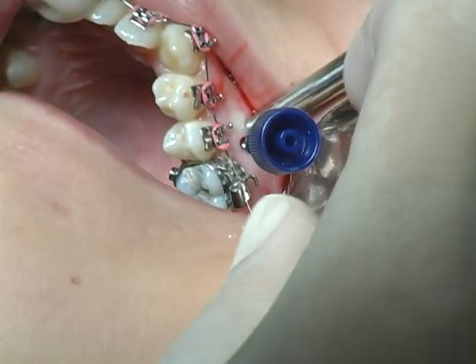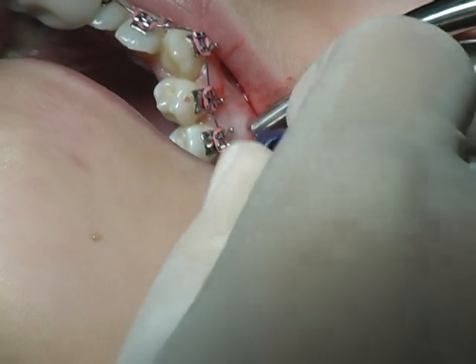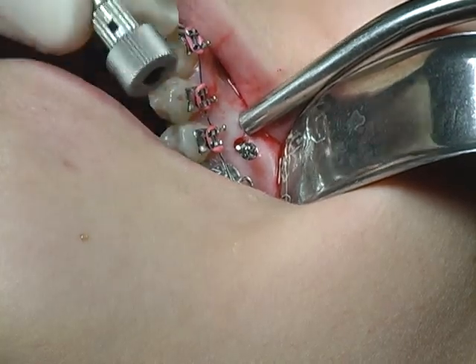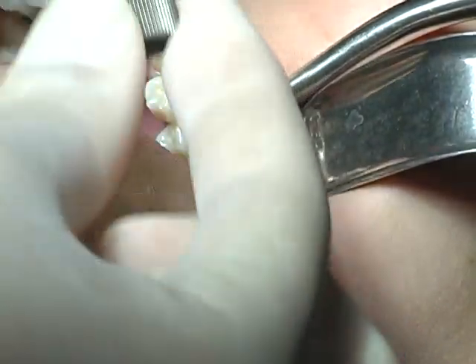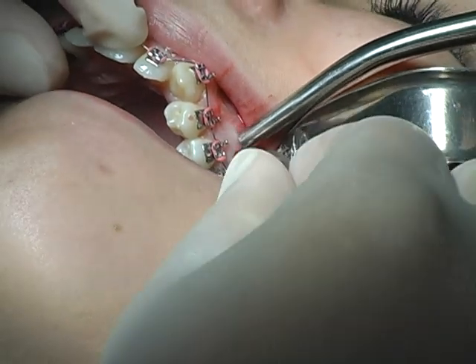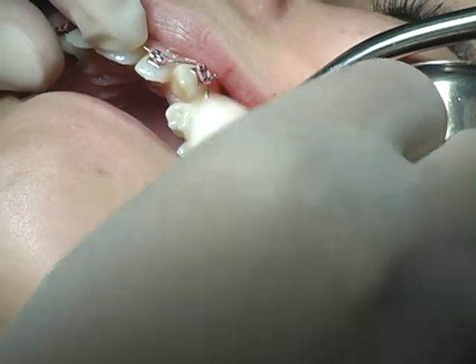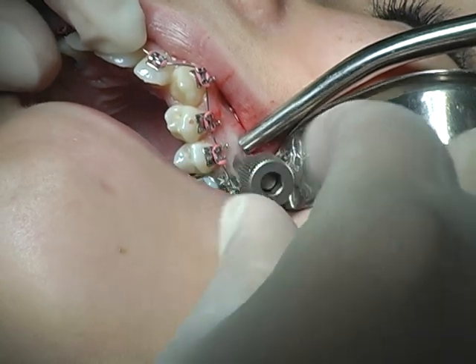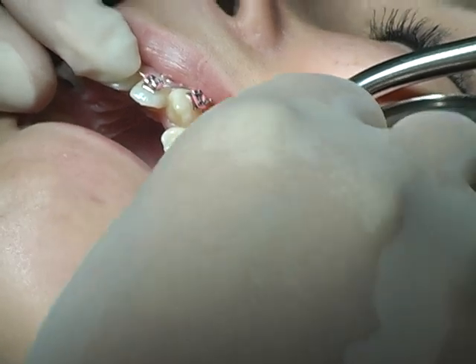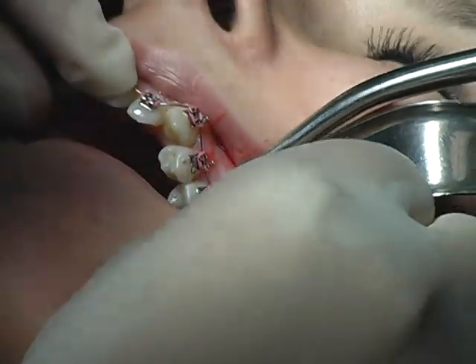Then I take my 8-millimeter pin, find my hole, and put it in there. Do one, two, or three revolutions — it's easy to go in. Then I take the applicator and wheel that was assembled already before, put that on top of my pin. There's no big resistance. I won't need the ratchet on this patient because it's going all the way down easily. Just have to make sure when it's at the end.